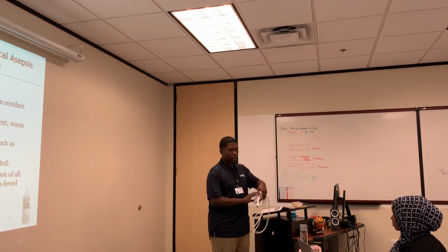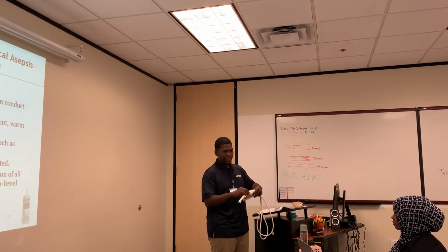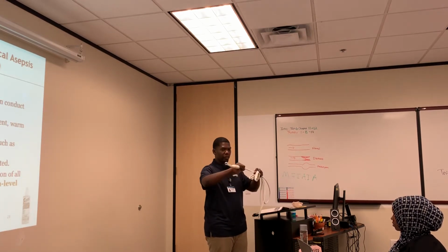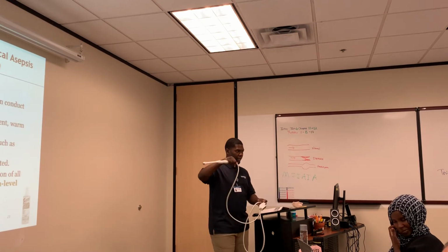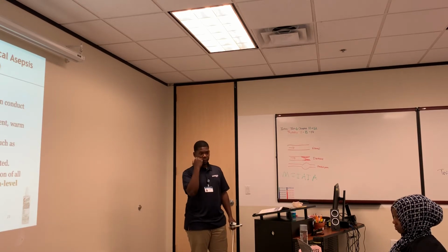I'm going to clean it up. I'm not going to suspend it all the way in, because you don't want to suspend it all the way to the cord. It usually has a little line that tells you where to stop at. This one doesn't, but it usually has a little orange line on the cord to show you where to hang it. So yes, if you're doing a translabial exam, then you can sterilize any other transducer the same way.